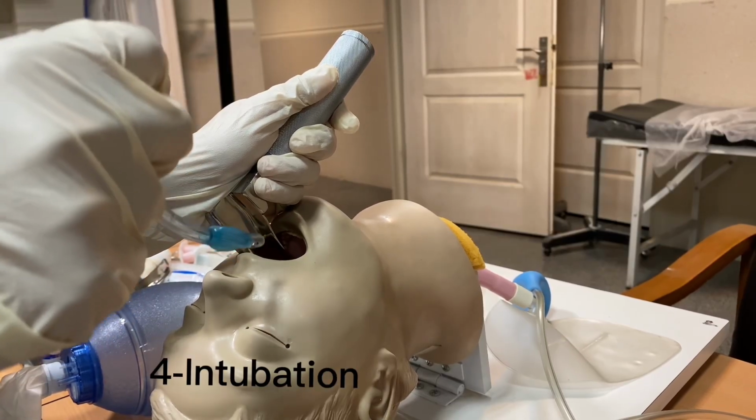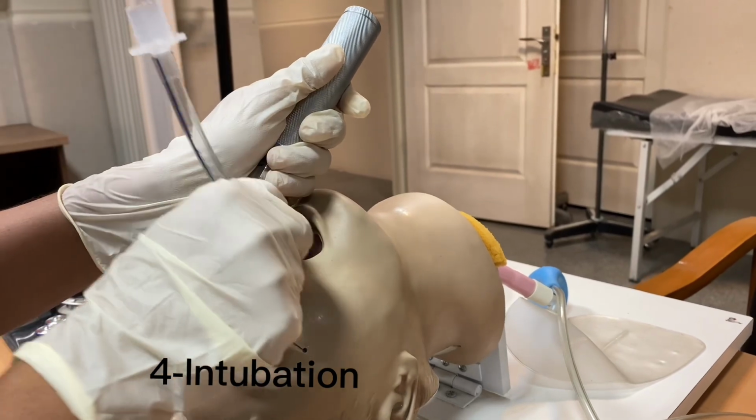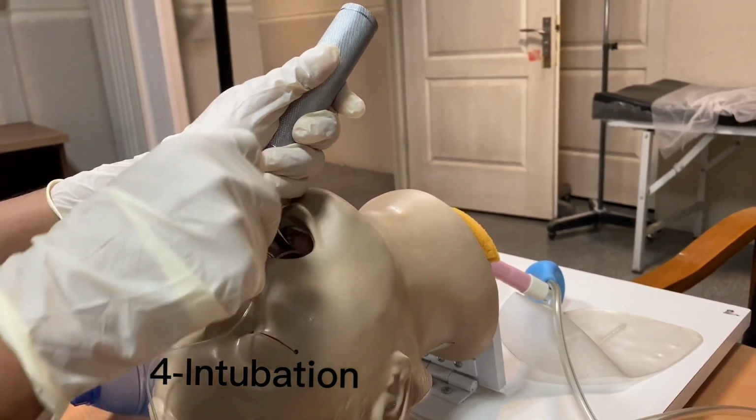Step number 4 is intubation. Take the endotracheal tube in your right hand and insert it through the vocal cords.